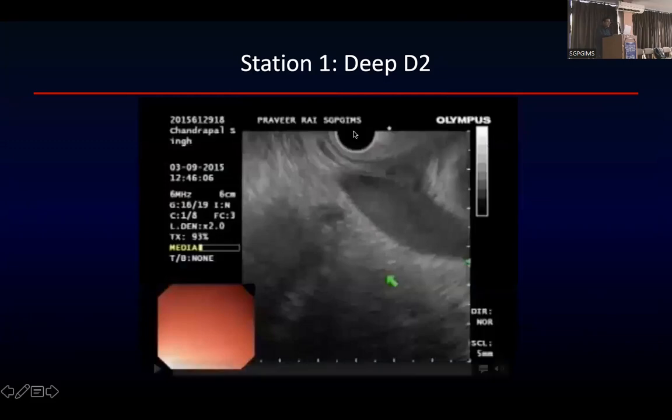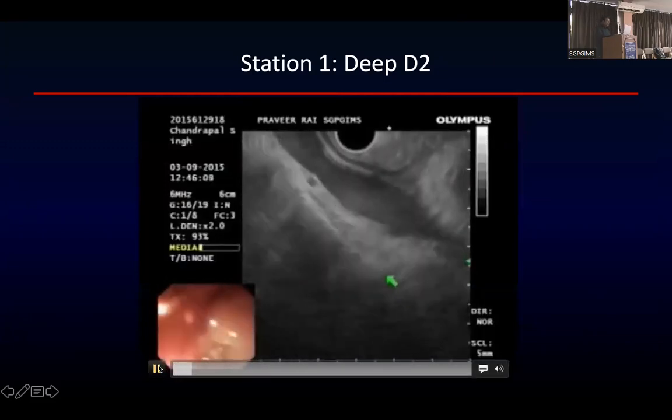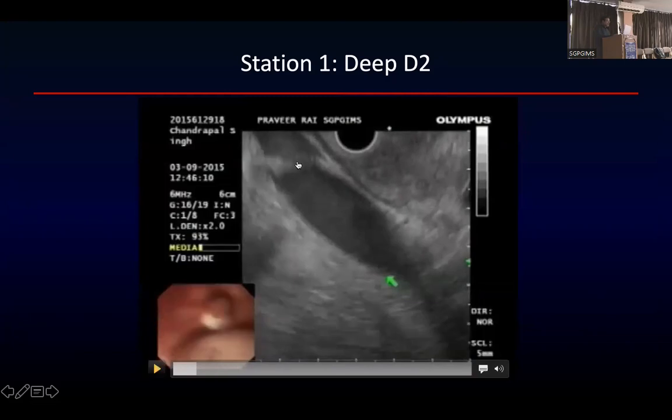Okay, just a quickly video दिखा रहा हूं मैं. So this is, you see there are 2 structures. एक ये है, एक ये है. Okay, ये aorta है, ये IVC है, दोनों parallel run करती हैं उधर. So IVC has got thinner walls. Obviously, you can apply the pulse Doppler to find which is artery, which is vein. Normally, you will not get confused. This is the aorta. This is the IVC.